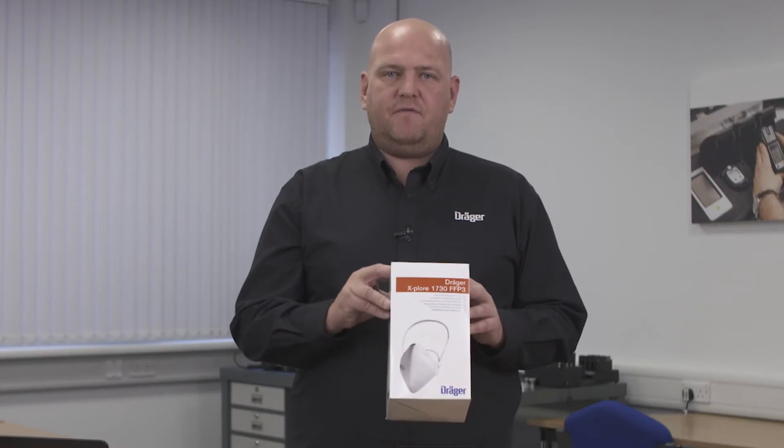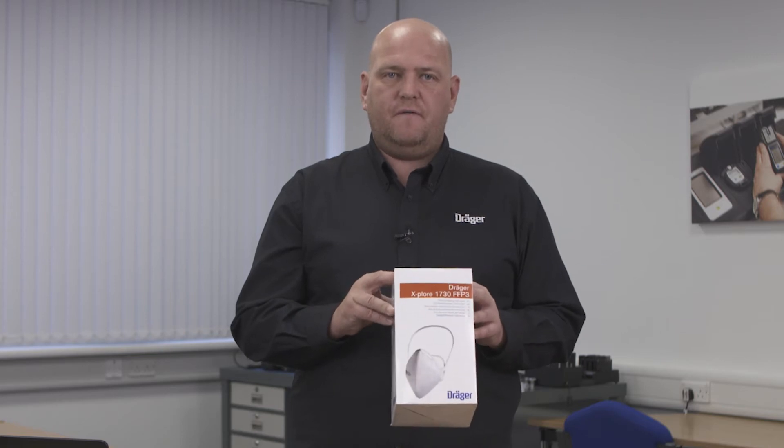Today I'm going to show you how to perform a test using the Draeger Explore 1730s with the quantitative face testing procedure.